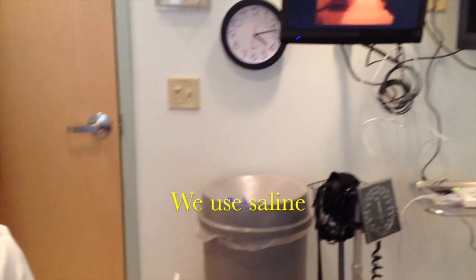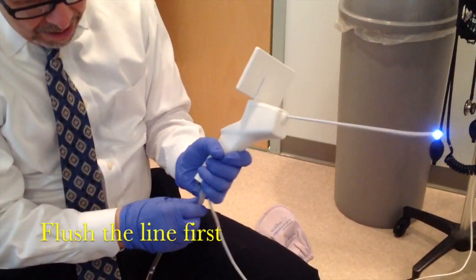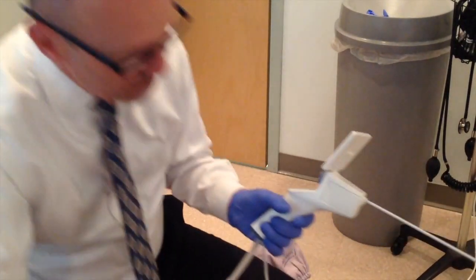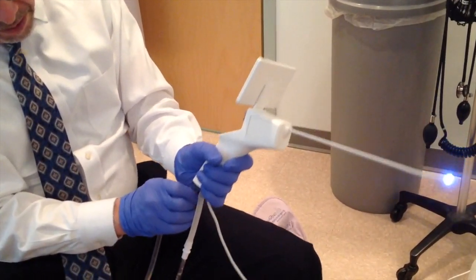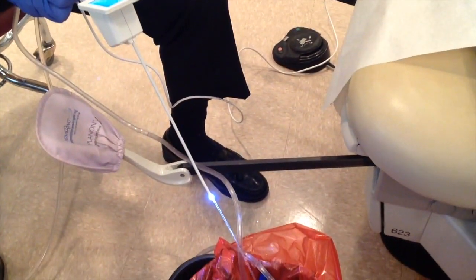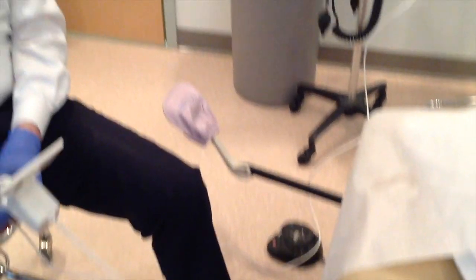Then we'll hook up the water — it's really easy. This is sterile at the time. We have an inflow here. Just hook it in right there. So now we have an inflow, and the outflow is just passive. The arrows tell you exactly where to connect it. You flush it through — I'll open the valve here because you don't want air in there. Perfect, nice flow. We found that you don't need to put pressure on it — it's a very fast flow.